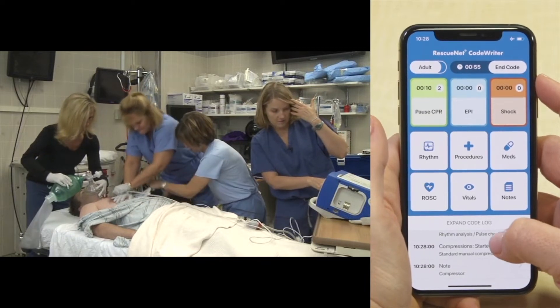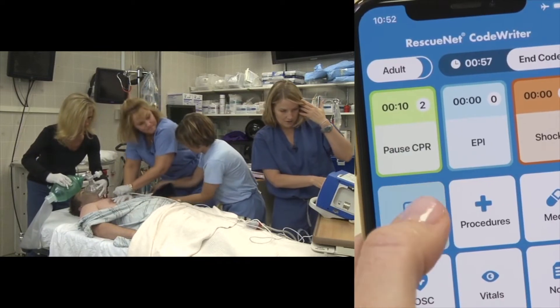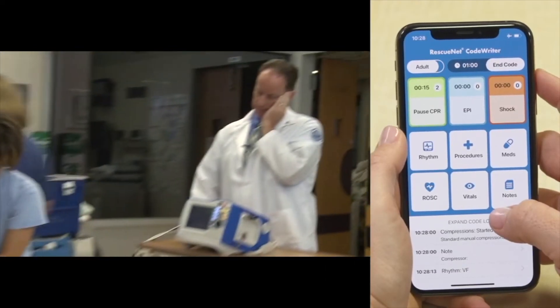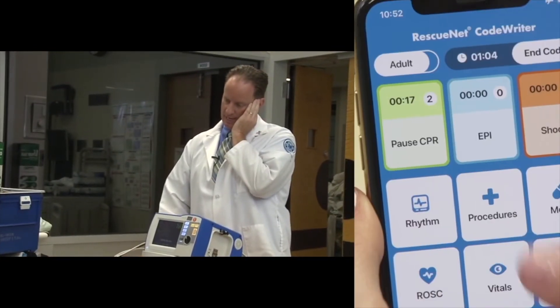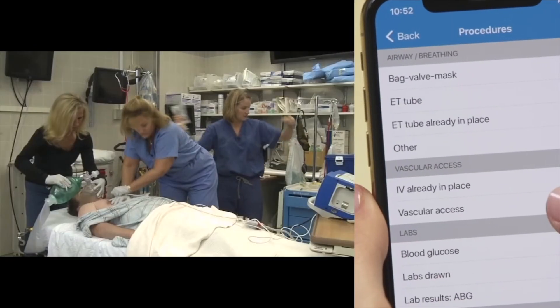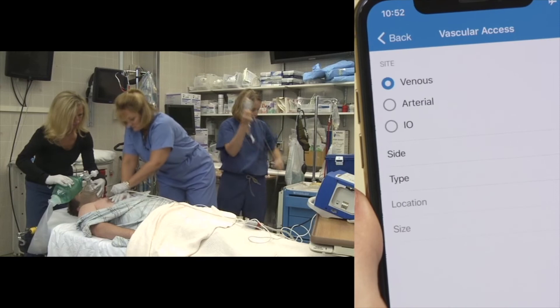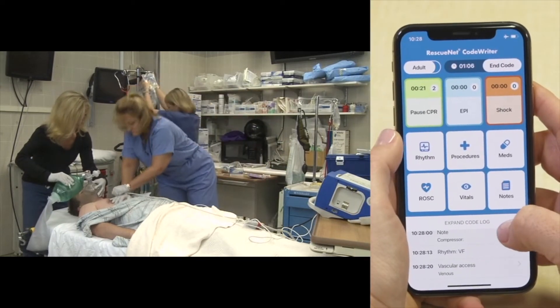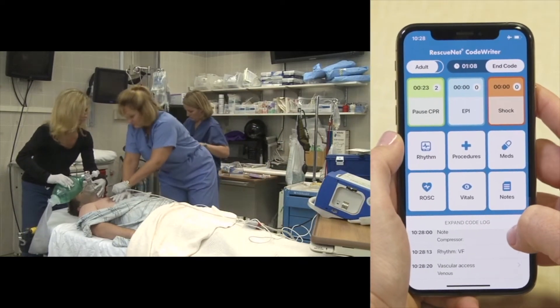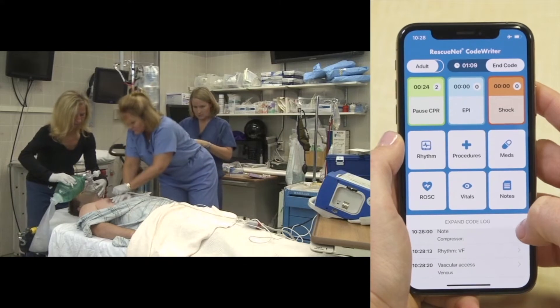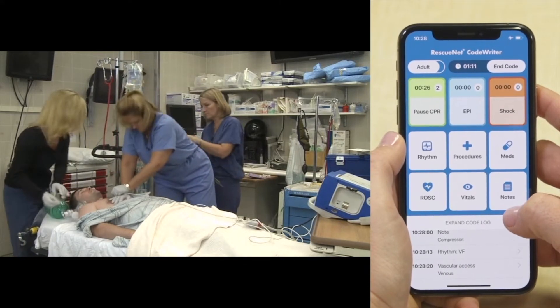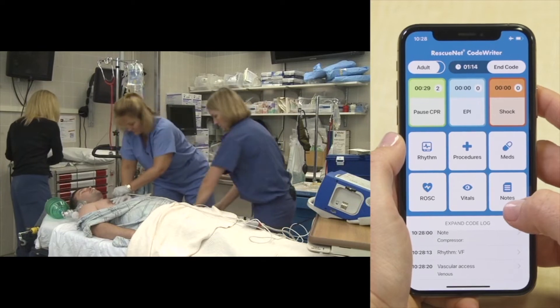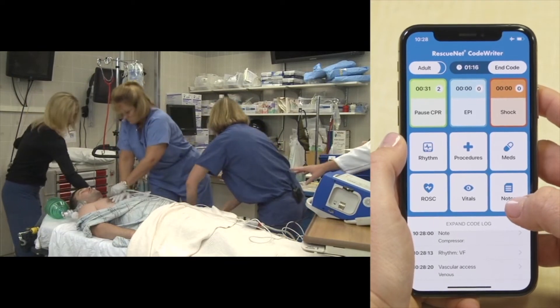The team checks the rhythm — V-fib is on the monitor. CPR continues while IV access is confirmed. Epinephrine one milligram is ordered and pushed. Saline is running wide open. The team requests confirmation when the epi is in and checks for good pulses with compressions.